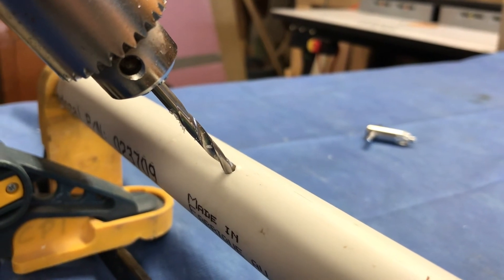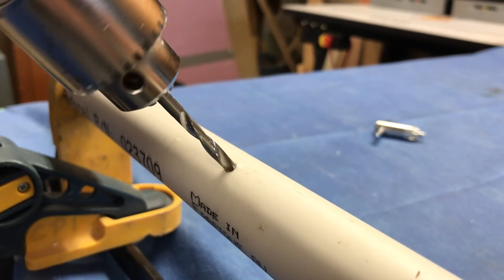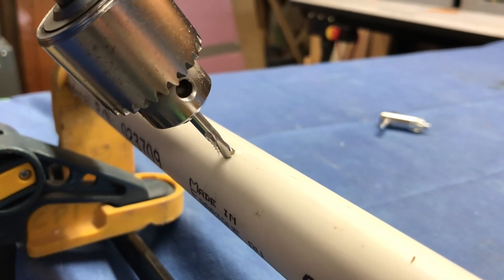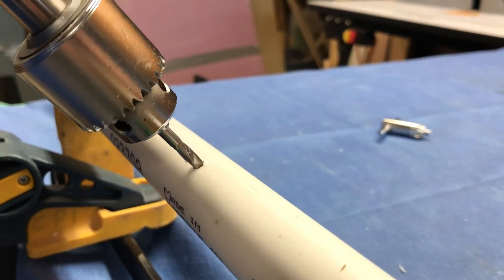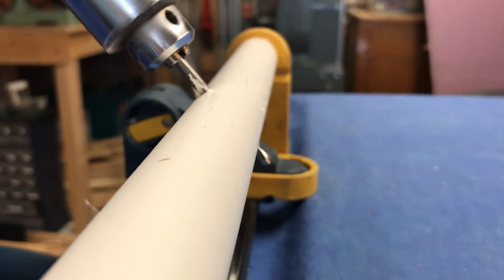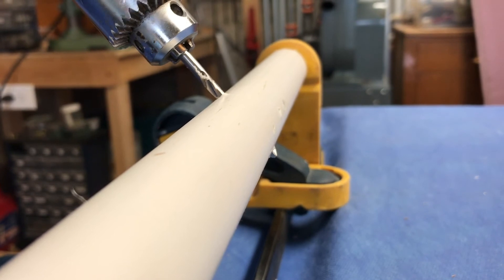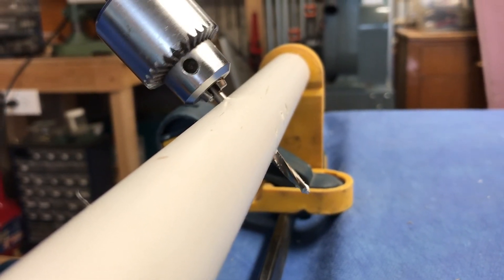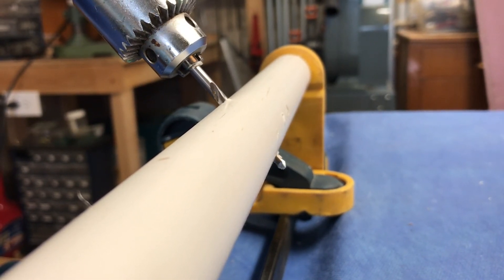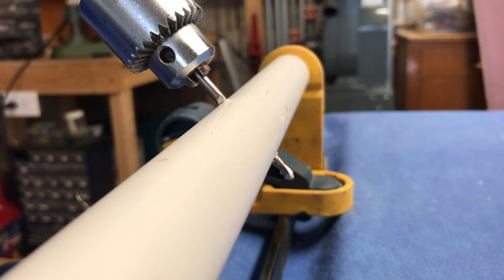Technical skill number six: avoid plunging. When drilling through the far cortex, be very careful to feel the tip of the drill engage and bite. At that moment, slow up the rate of drilling and reduce the amount of pressure on the drill bit so you don't plunge. If you drill with too much pressure without feeling that bite, you can easily plunge through and perforate important structures on the other side. The technical skill is to recognize as the bit bites that you back off, slow up the rate of drilling, and reduce the amount of pressure on the drill handle.